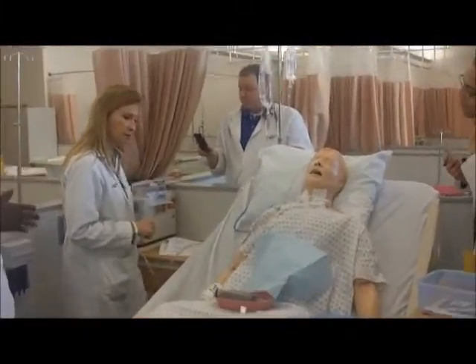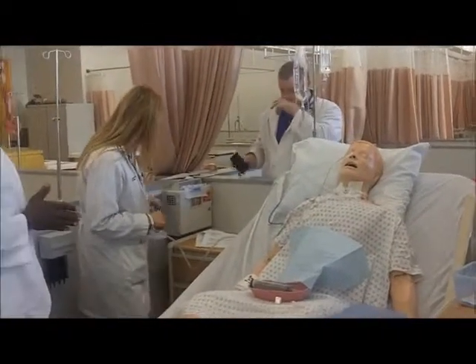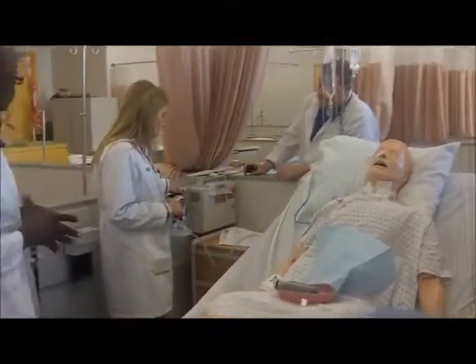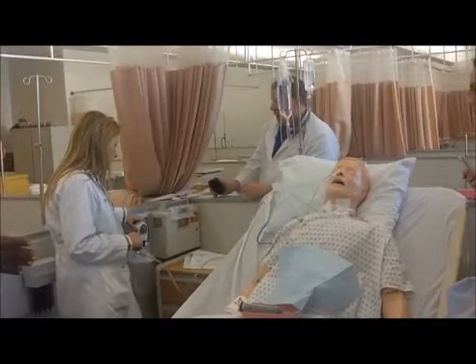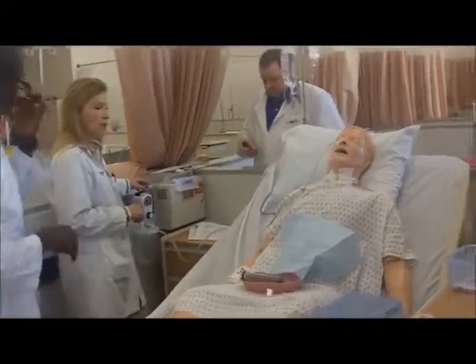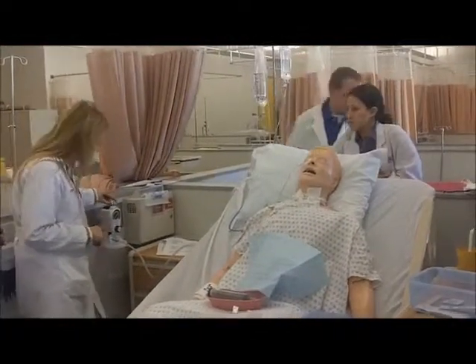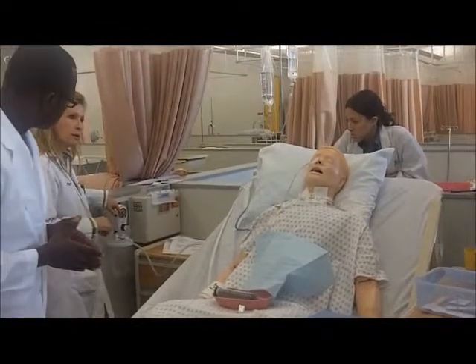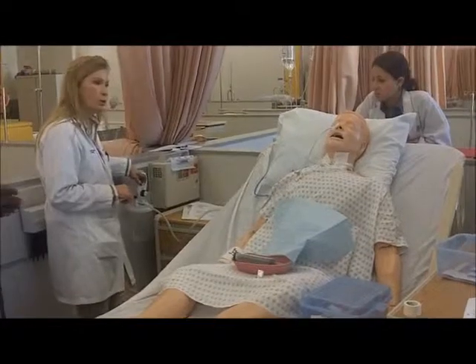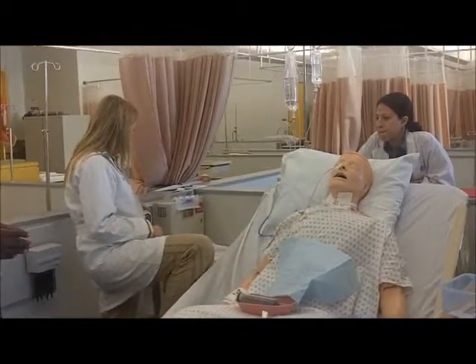Okay, any questions? As part of the testing, do we need to put that to a certain pressure? No, just connect it to low intermittent suction. When the doctor gives you an order to place an NG tube, most of the time he's gonna say attached to low intermittent suction. He's not gonna say 35, 40, but usually your low is the green to yellow area. Your high suction would be when you're suctioning a patient respiratory that you need high suction. You use common sense.